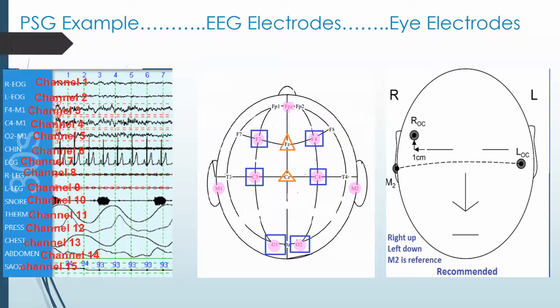It's because we use the FZ electrode, and inside the computer, nowhere that we set up, that's just automatically doing it, the computer has all the electrodes referenced to the FZ electrode. So in computerized sleep systems, we have to have a system reference, and that is our FZ electrode. Some sleep centers may use a different electrode for that, but it's pretty standard that people use FZ.